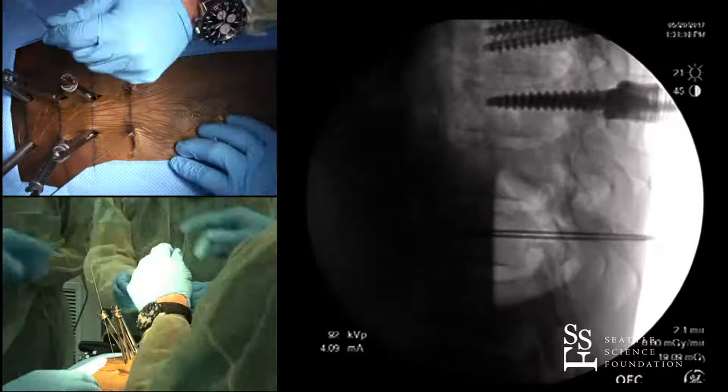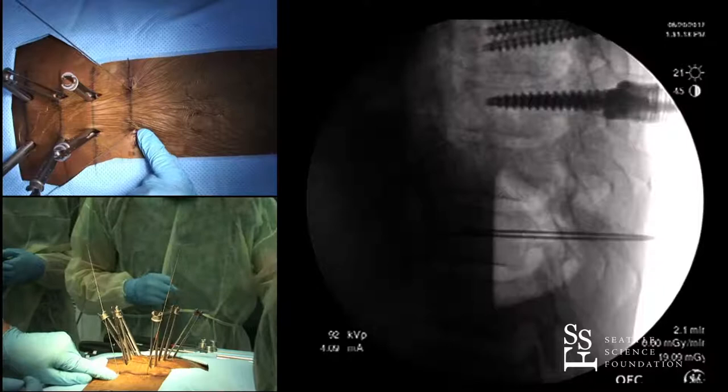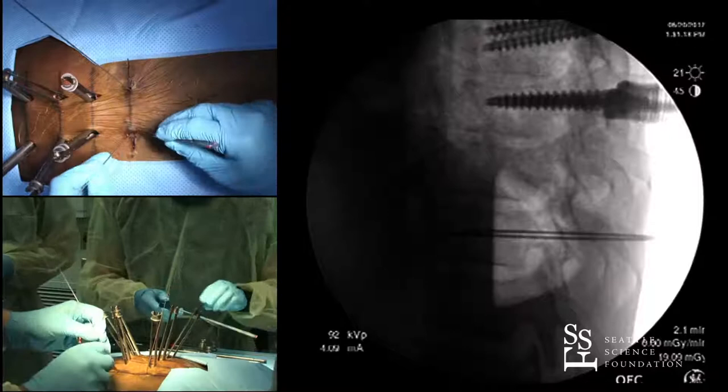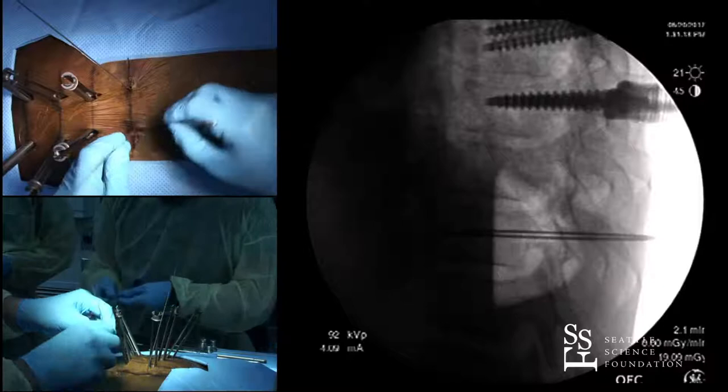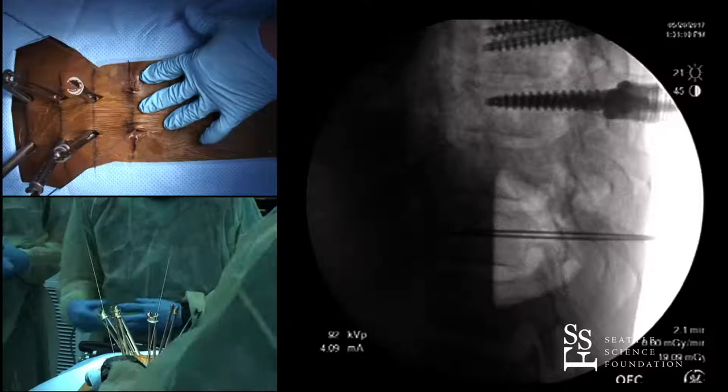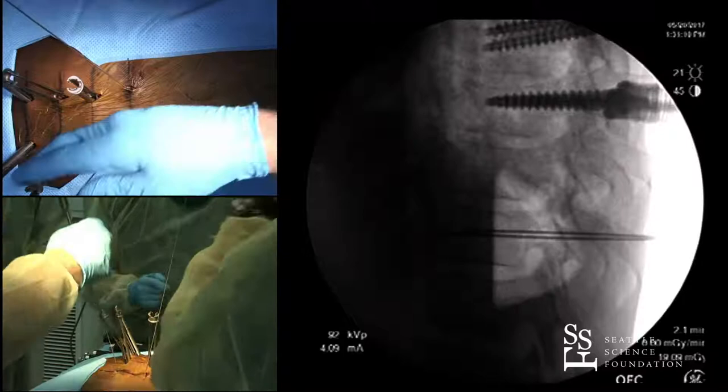You can see both wires in place. Initially I only make a stab hole — if I have to adjust my starting site, I don't want to feel obliged to use that hole. I like to be able to make another hole; I don't want a big meandering incision. Once I've got my screw in and I'm happy, I'll widen the hole down through the fascia enough to accommodate the screw. Depending on the system, I'll either use a tap or not.